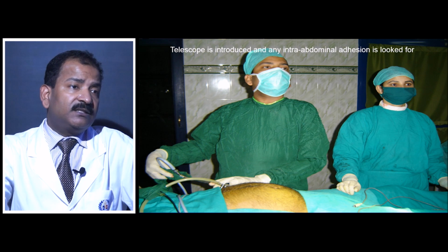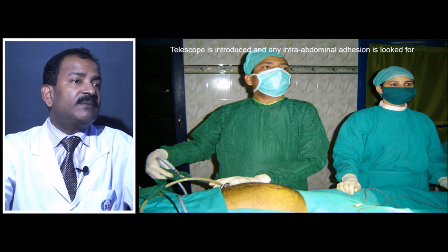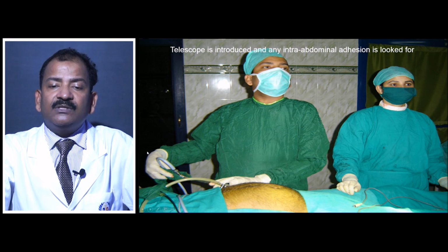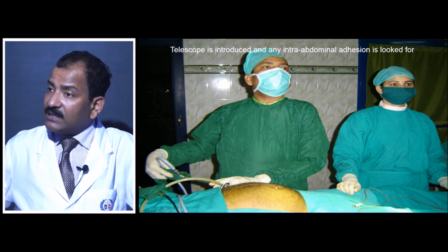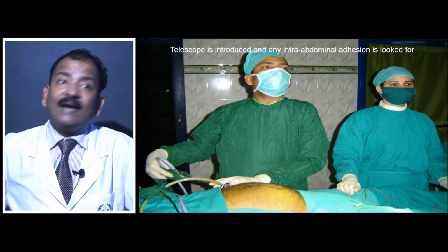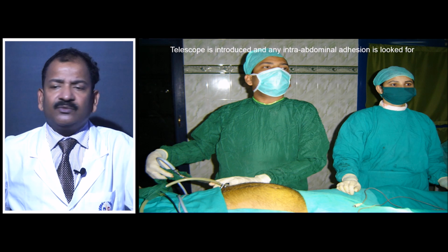If you are a gynecologist, you cannot do TLH keeping your telescope in Palmer's point. So, what you will do, under the vision of this telescope, is put another trocar into the umbilicus. So that now you are under vision, so you are safe, either umbilical or supraumbilical, depending on what you want to do.